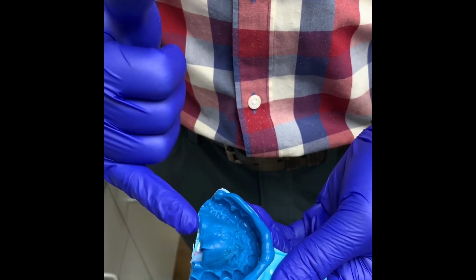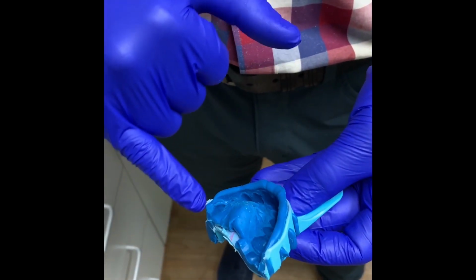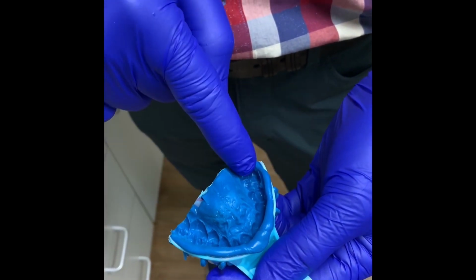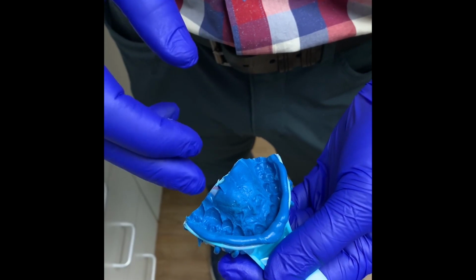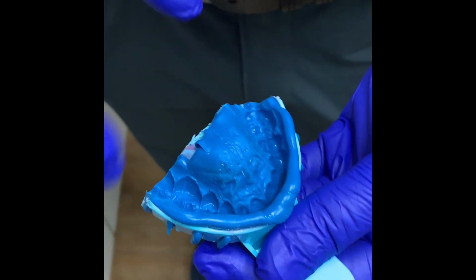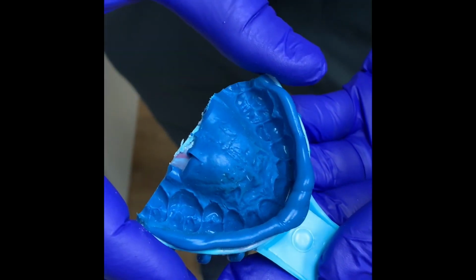The last step of cutting the distal end off is entirely optional, but I like to do it because there was some interference on the tray over here. We've still got at least 1.5 teeth on both sides behind where our temporary is going to be from 5 to 12. And we've also got the palate to ensure stability when we seat this in the patient's mouth.